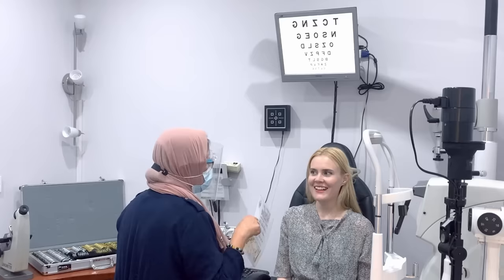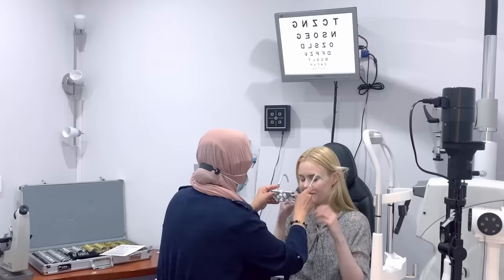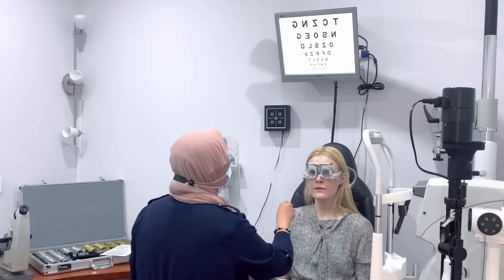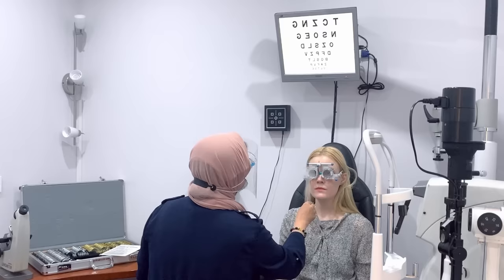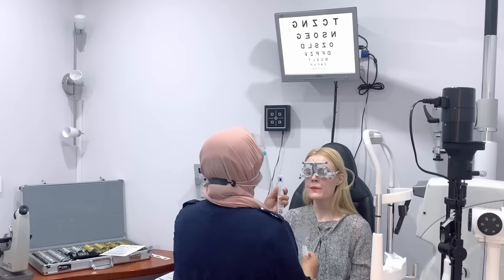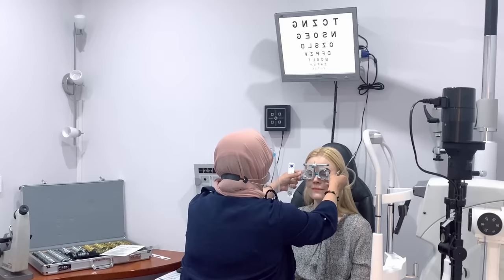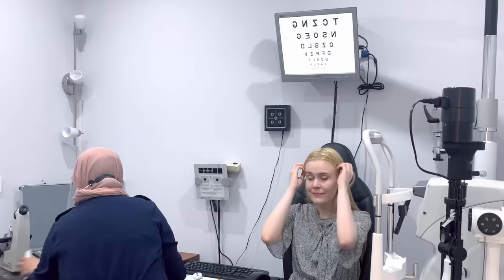All right. Thank you. So let me put this back on you again. And then I'll get you to put your mask back on while I take this off, but not yet. Give me a second, yeah? So if you look straight ahead for me and just look at the letter, maybe the P there, yeah? I'm just looking at your muscle movement at the moment. I just want to make sure your eye muscles are working together as a pair, okay? That's perfect. Now look towards me. Concentrate on the F. Thank you. Watch the F. That's perfect. Well done. That's great. And blink. Good. I'm going to take that off now, and we're going to just do that again, okay? So if I get you to now look at the letter F, just watch the F. Well done.